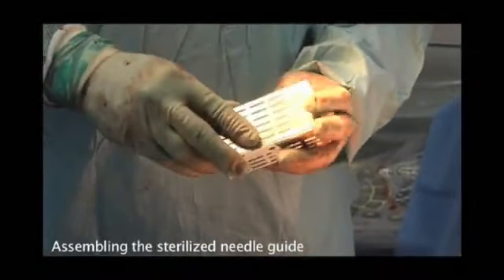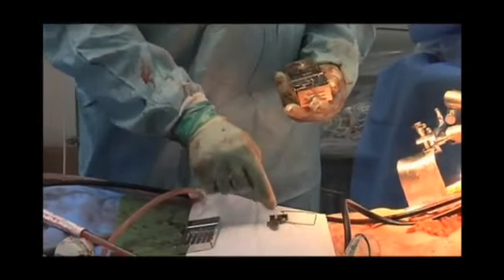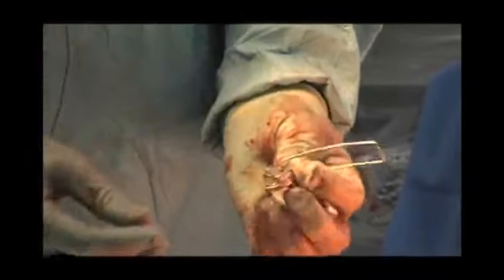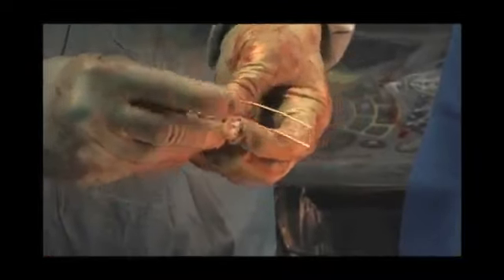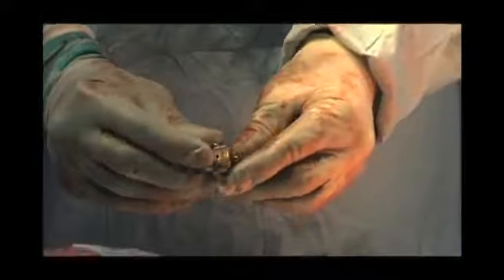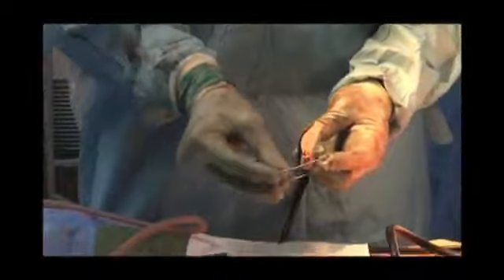There is a small box here containing the devices which we need for this steering. As we can see, there are three channels, which we are going to select between for which angle we perform the puncture under. So this is the devices which we need, and then we will have to assemble it. By placing this locker system here, which has a small tap containing the movable part in a position where we can utilize it — I just open it, place it, and close it again. Now the whole system has three access points in a fixed angulation, which we can fix to our transducer by this bracket.